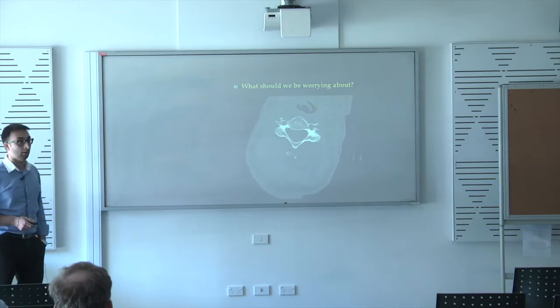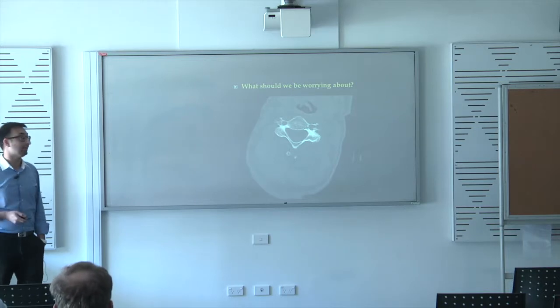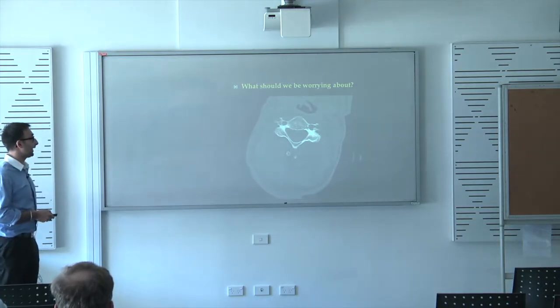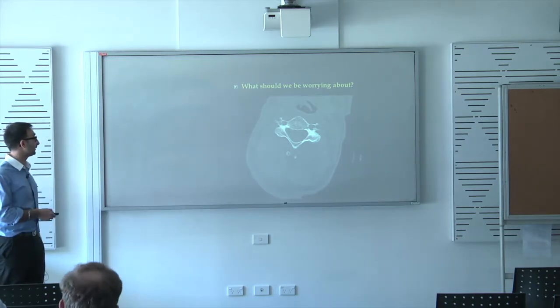So often when I'm on call and I have a trauma, I always make sure I look at the transverse foramen in a C-spine injury, because what that means is, do you know what we can go on to do then? CTA, yeah. So we go on to do a CTA, and that means changing slightly the way the protocol runs. We basically have to give them contrast earlier and then scan the neck again.